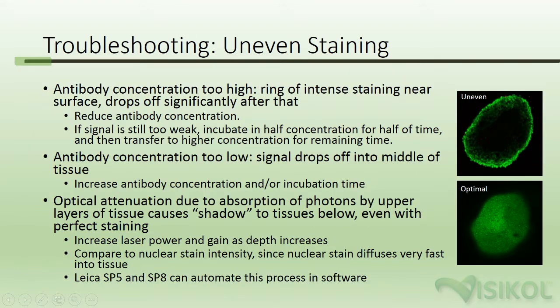Troubleshooting. What do you do when you get uneven staining? If your antibody concentration is too high, a ring of intense staining near the surface can be seen, followed by a significant drop off in intensity towards the inner parts of the tissue. The solution is to reduce the antibody concentration. If the signal is still too weak, incubate in half the concentration for half the time, then transfer to a higher concentration for the remaining time to avoid antibody getting held up in the outer layers. If your antibody concentration is too low, you will see the signal drop off gradually towards the middle of the tissue; increase antibody concentration and/or incubation time.